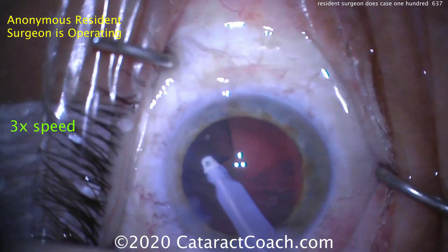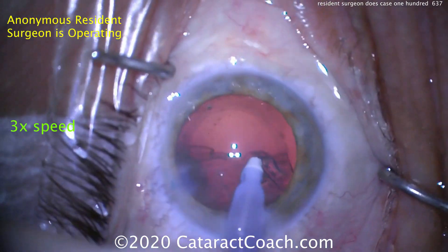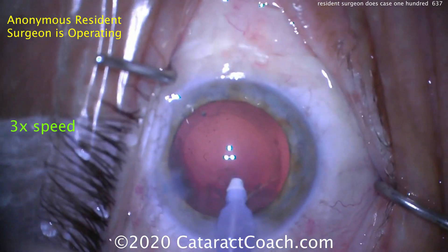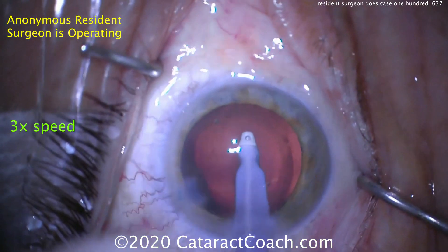It just takes time, building on every subsequent case. Now cleaning up the cortex — let's see the technique. So doing a central stripping; that does definitely work. Maybe next time switch to more of a circumferential technique, as I tend to prefer in my cases. I think it becomes a little bit more efficient. And that looks great — cleaned up beautifully.